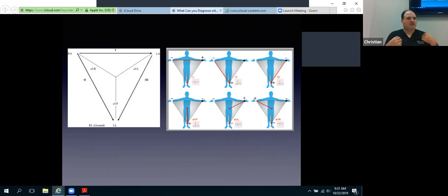They're put on the torso during exercise stress tests as a compromise, where placing leads out on the limbs while you're asking somebody to move their arms can create a lot of motion artifact, and so it's difficult to interpret the ST segments, and so they agreed that, okay, for stress tests, you can put them on the torso, but there's a lot of variation when you're doing that, and it's not diagnostic.